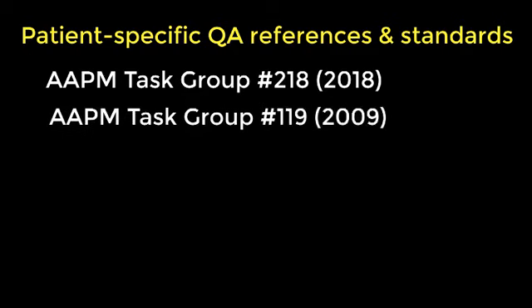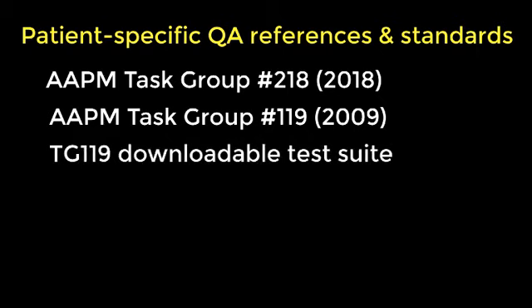We have AAPM Task Group 119, published in 2009. That talks about commissioning IMRT and some of the tests that are associated with that. And then that group actually has a downloadable test suite.